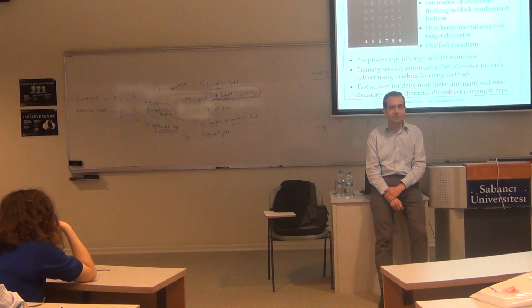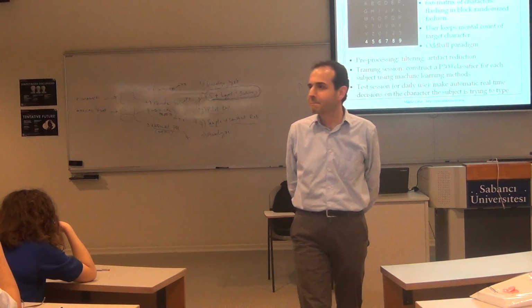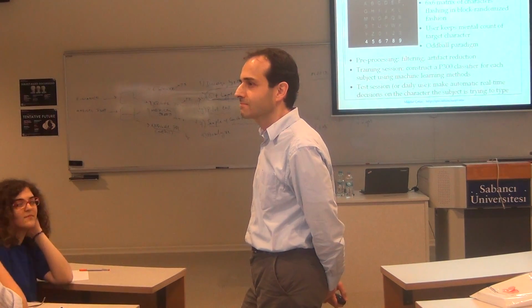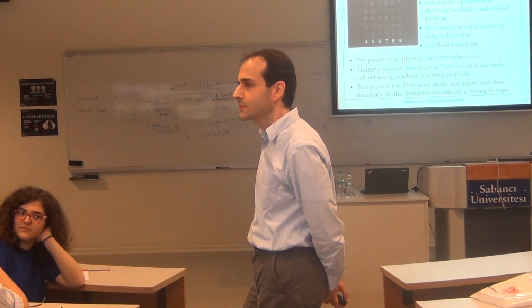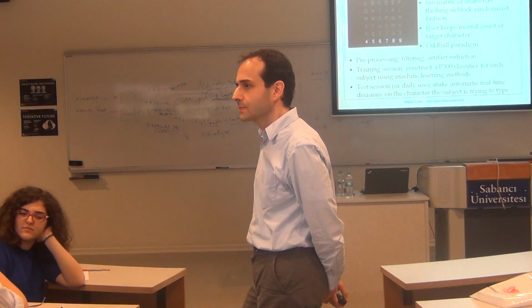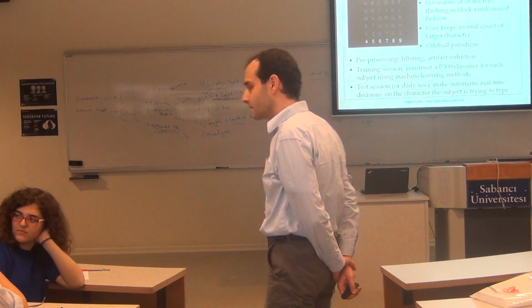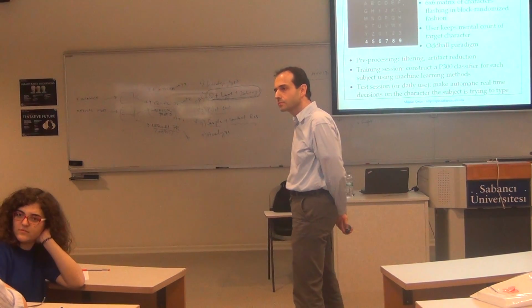Other questions? Go ahead. The thing is that in this kind of setup, for any letter, the row or the column which is related to that letter should be flashed more than one time, so that the algorithm can understand and decide that letter and differentiate it in comparison to the others.